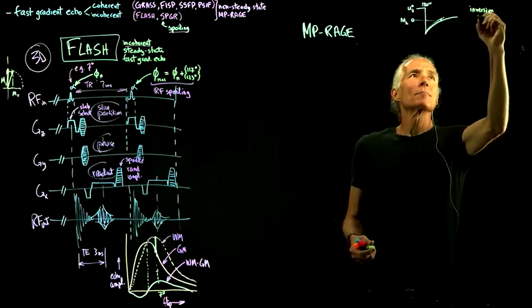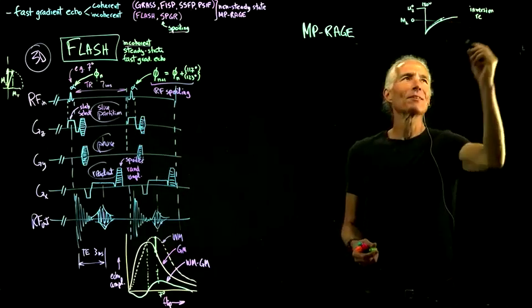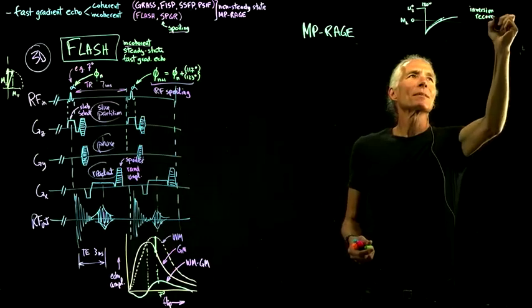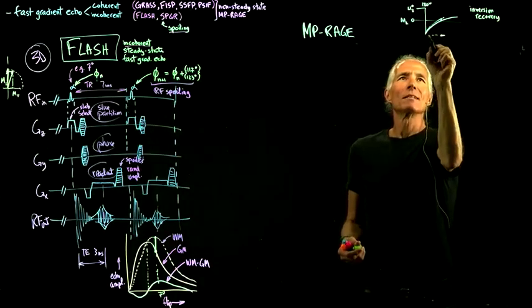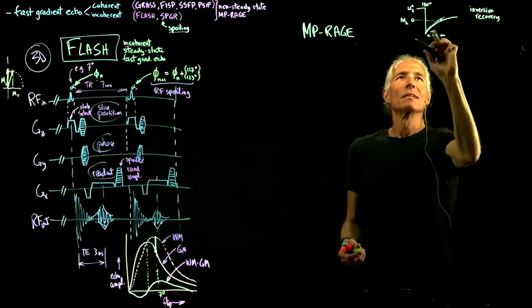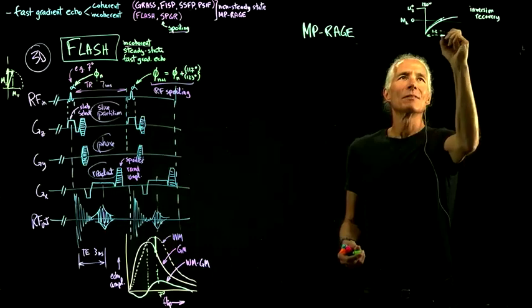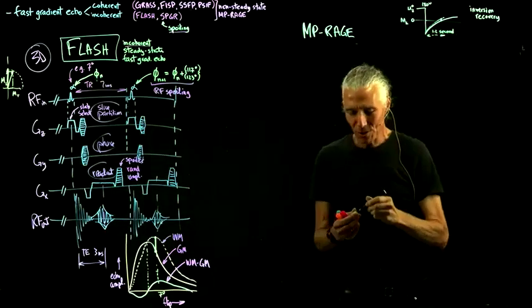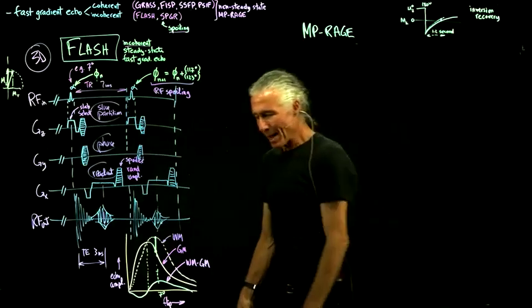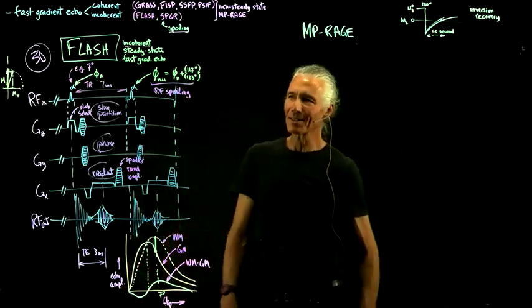But the problem with that is that there's only a moment in time when that occurs, and you have to wait a long time, at least 1 to 2 seconds. That's a really long time. So there's slow inversion recovery. I sat in the magnet in the 90s for slow inversion recovery. I spent like an hour in the magnet just recording one image.